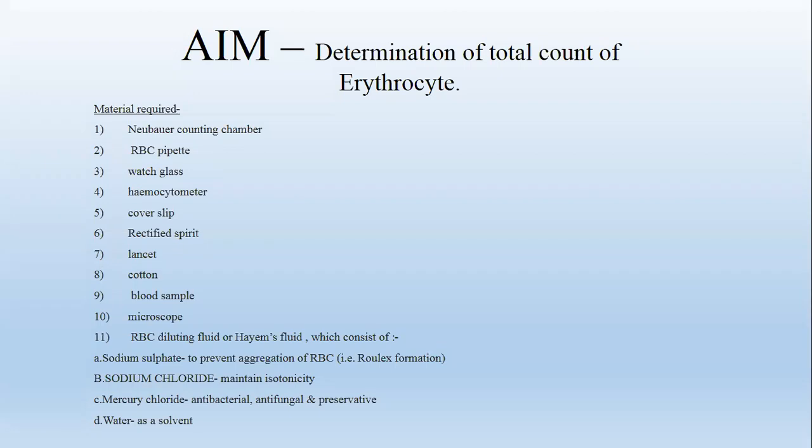Materials required are: first, Neubauer counting chamber, RBC pipette, watch glass, hemocytometer, cover slip, rectified spirit, lancet, cotton, and blood sample.